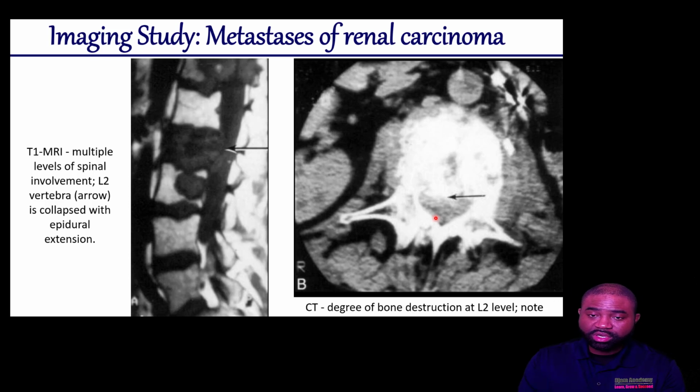Now, before we go on to the next slide, here are a couple of things that I would like for you to bear in mind. One, vertebral metastases are often hypointense in T1 images relative to the normal bone marrow, but T1 weighted images with gadolinium normalize the tumor appearance, typically by increasing its intensity to that of normal bone marrow.